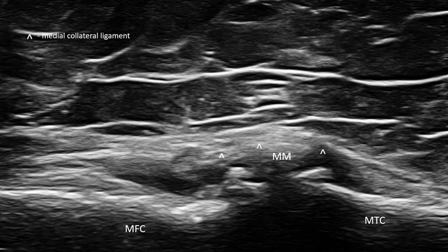ligament. When the medial compartment presents in this way, advanced cartilage degeneration should be expected on the weight-bearing surfaces of the medial femoral condyle and medial tibial plateau. Definitive assessment requires direct evaluation of the cartilage.